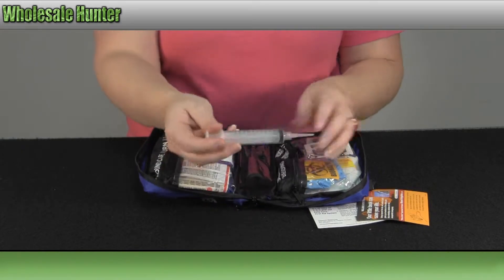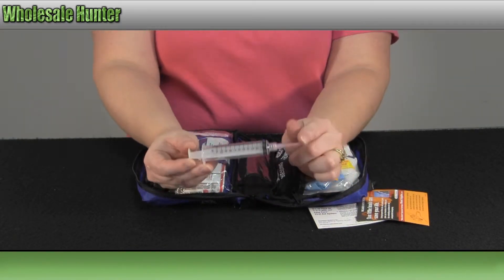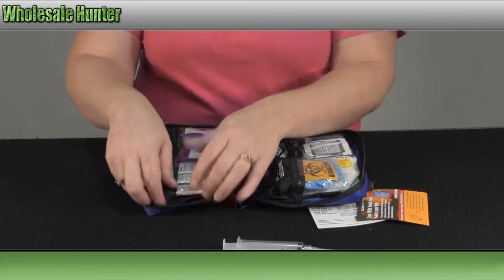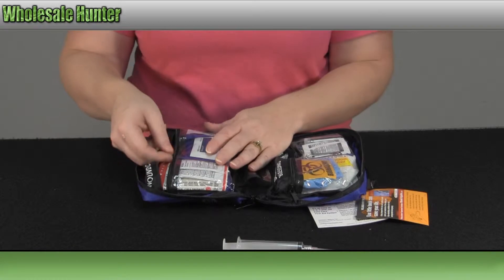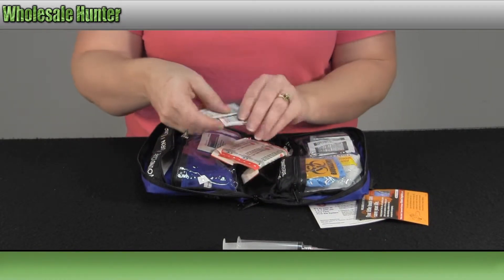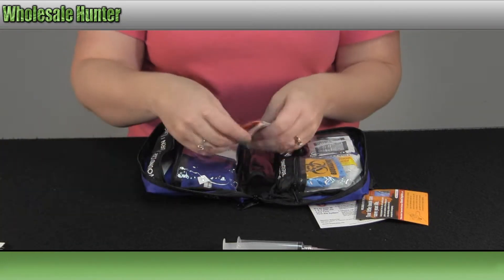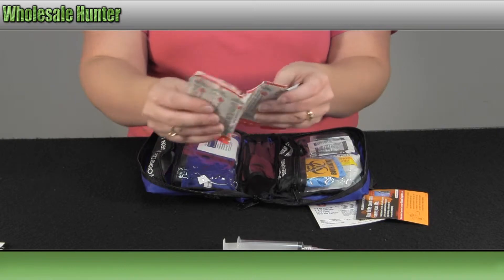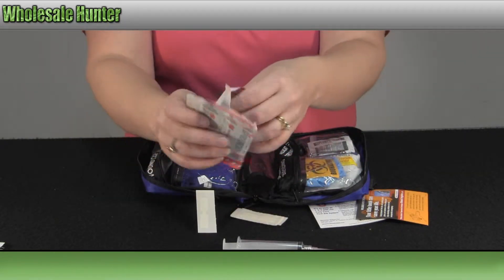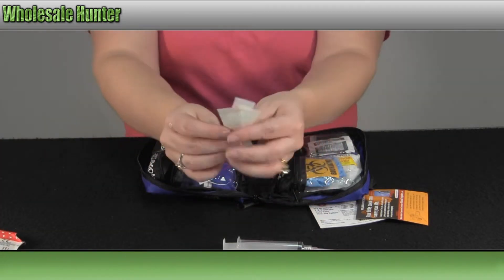In the middle here you have your 10cc syringe with your 18 gauge irrigation needle. You have your 3 packets of triple antibiotic ointments. Several different sizes of your adhesive bandages. Plus you have your butterfly sutures.